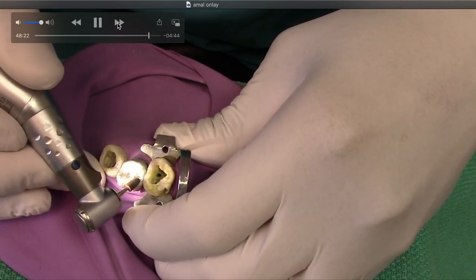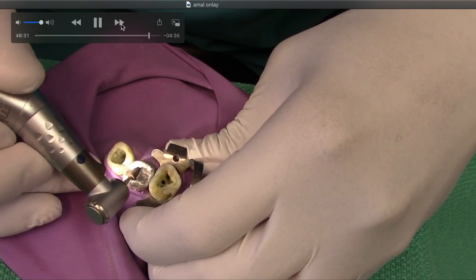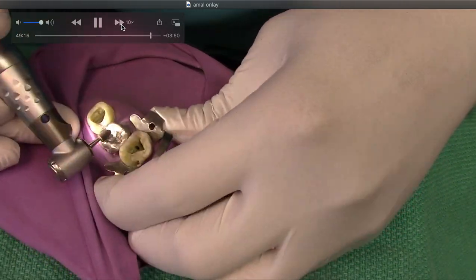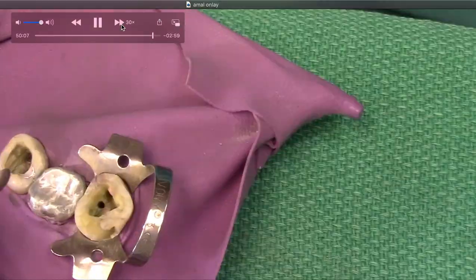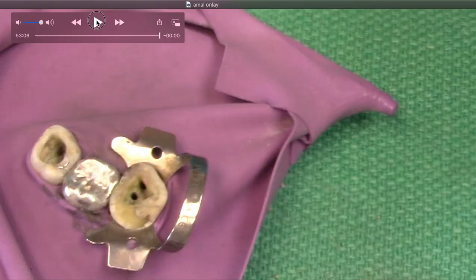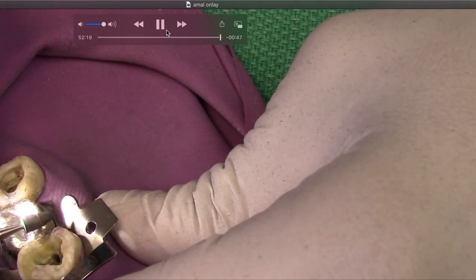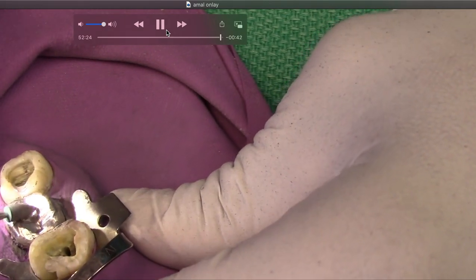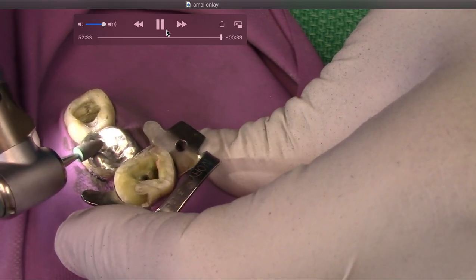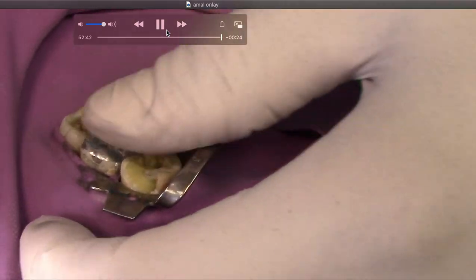We are going to polish it. We let it set for 24 hours — the book says 24 hours, though I'm not sure if that's entirely true. We use a brownie point at slow speed and then a greenie point just to make it look nice. It doesn't influence the outcome of the restoration at all. And that is our cusp coverage amalgam — or five-surface amalgam with cusp coverage. I hope there are some tips you can take away. When you start doing these, it's a really critical element of our practice — bread and butter, especially in root-canal-treated teeth. Get the patient fit for deployment and back to life. Hope you enjoy — cheers!